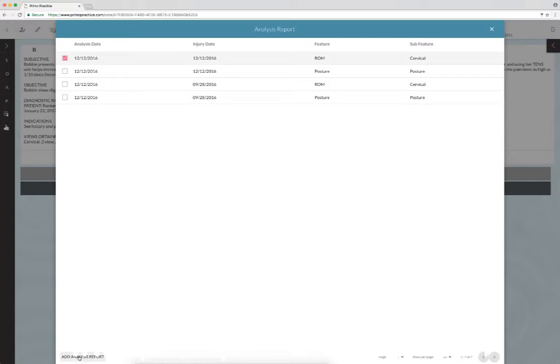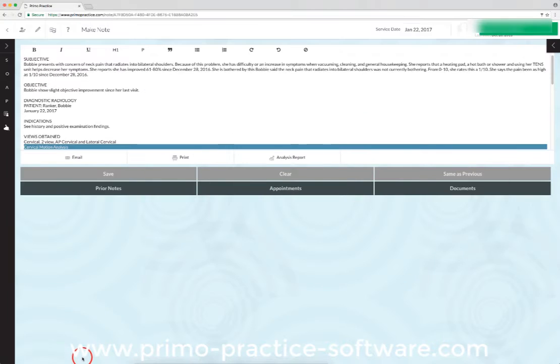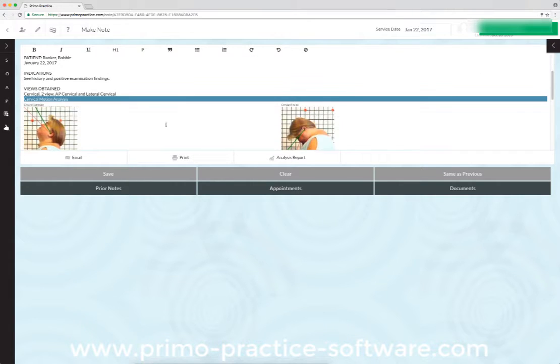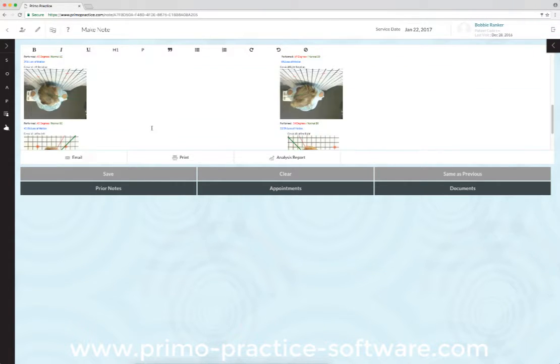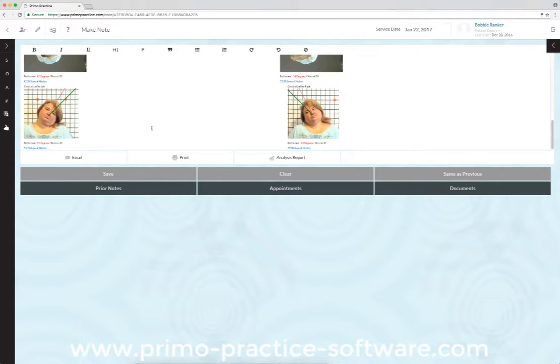Then we come down here to the bottom to add analysis report and click this. So when we scroll down, you'll see that her report has been added to the chart.